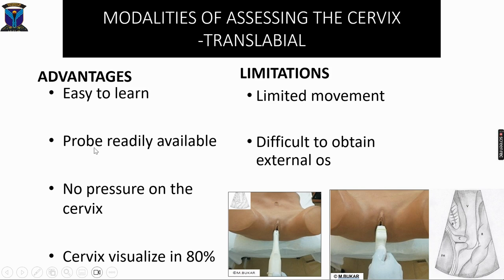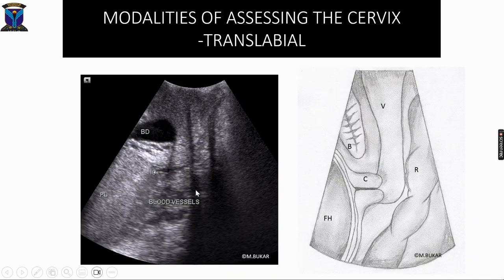Translabial imaging is easy to learn and the transabdominal probe can be used, which is readily available. There is no probe pressure on the cervix, and the cervix is visualized in 80% of cases. In 20% of cases, visualization fails — especially due to gas shadowing from the rectum. The external os cannot be visualized, movements are limited, and as seen here on this translabial scan, there is extensive shadowing from the rectum preventing visualization beyond the external os.